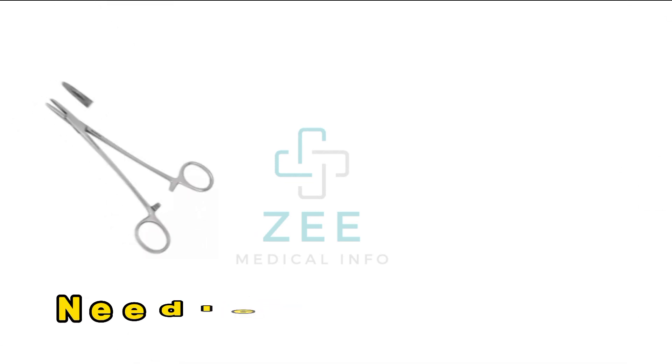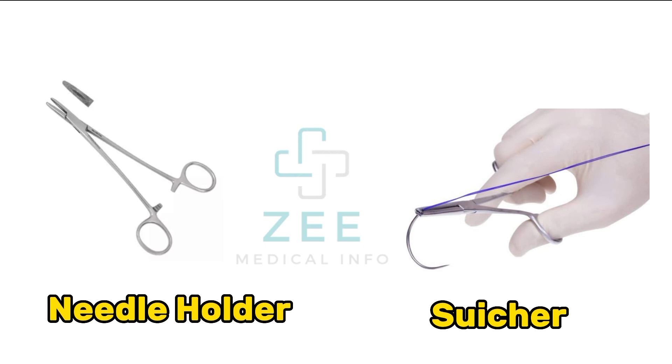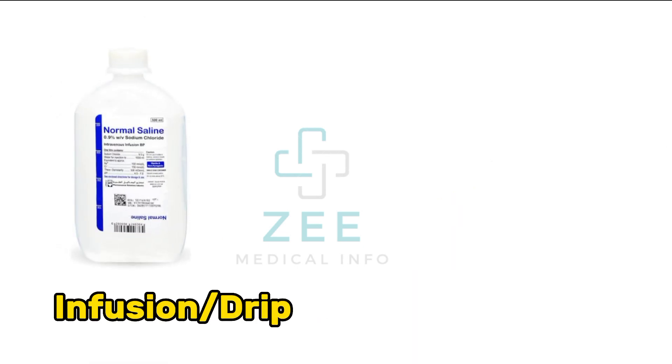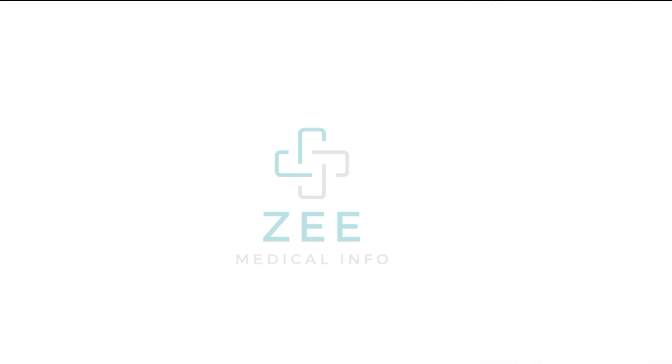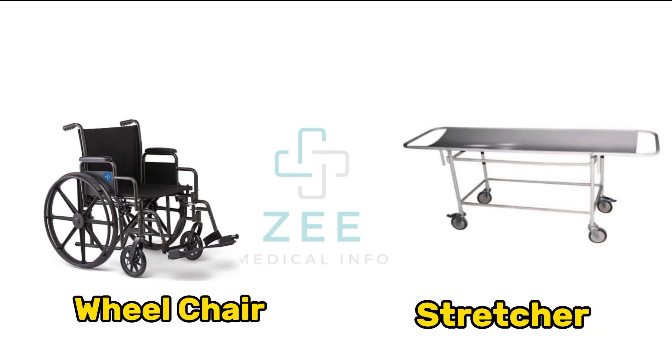Needle holder, suture, infusion drip set, wheelchair, stretcher.